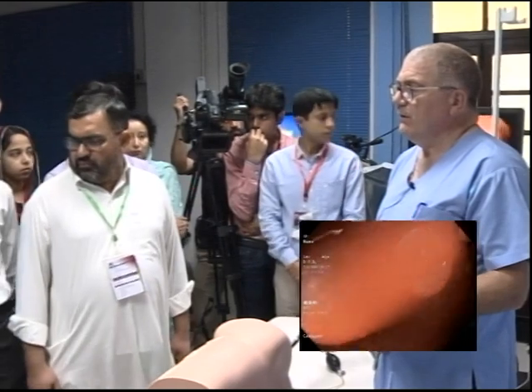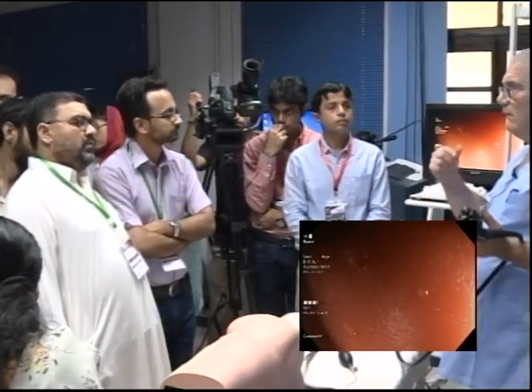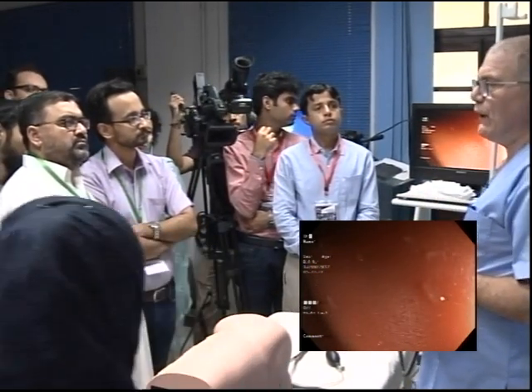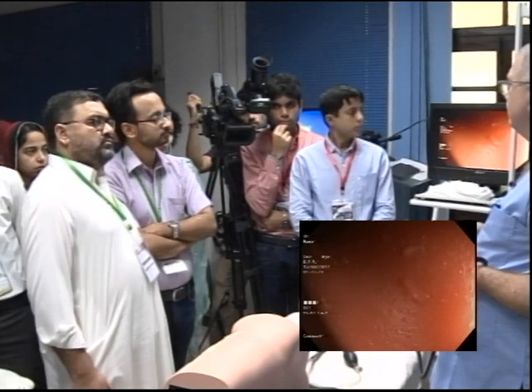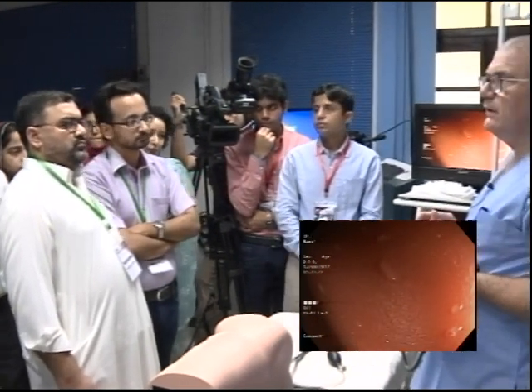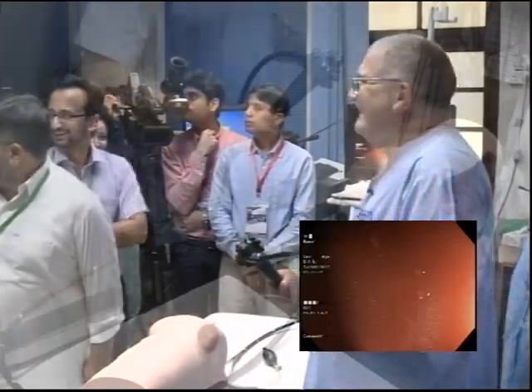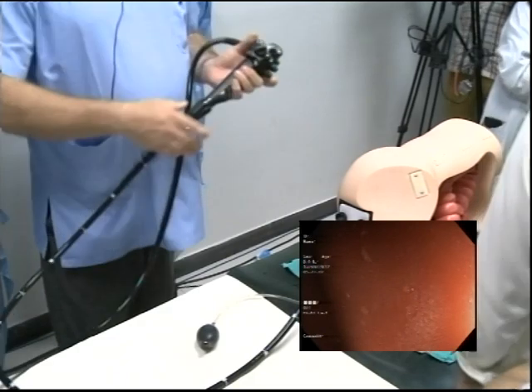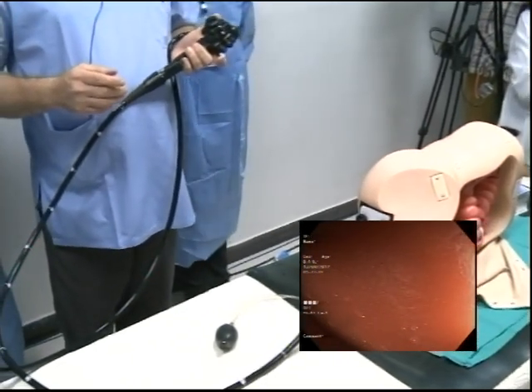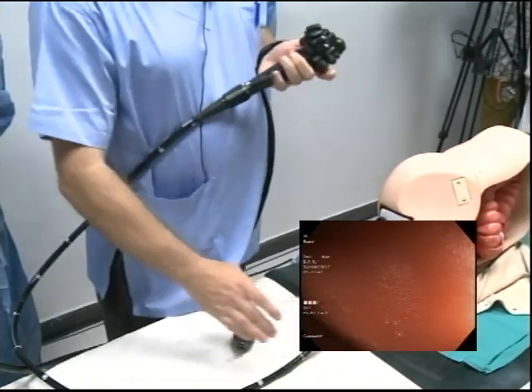Now, as we come through, we've got 3 folds in the rectum. 1, 2, and 3, roughly 5 centimeters apart. Do we know what they're called? Who's a surgeon? So what are the folds called in the rectum? Yeah, the valves of Houston.